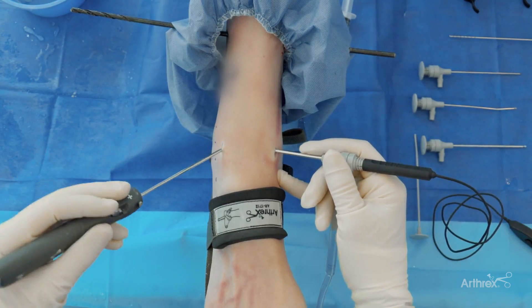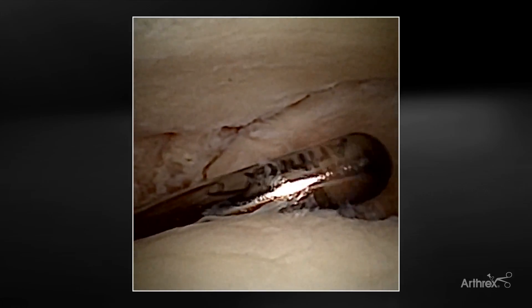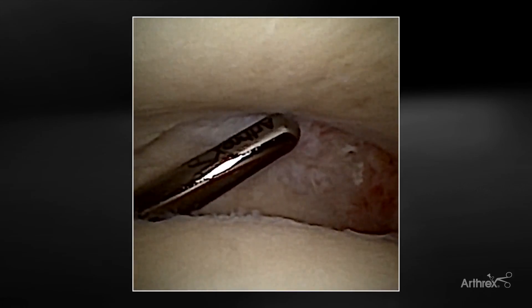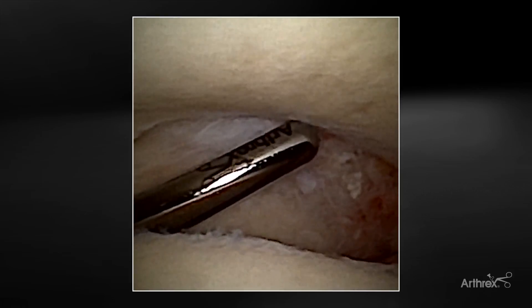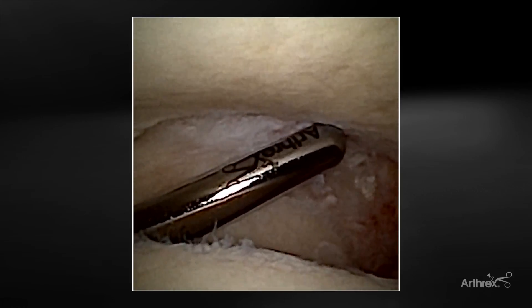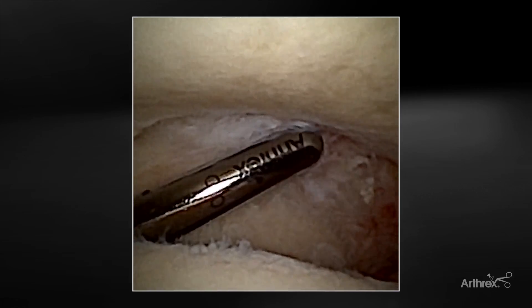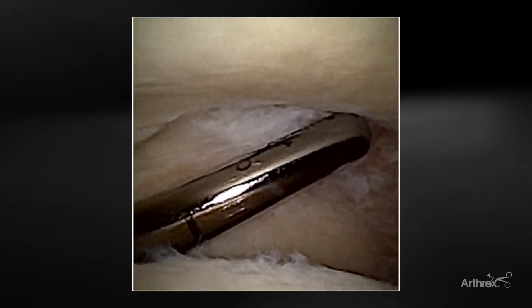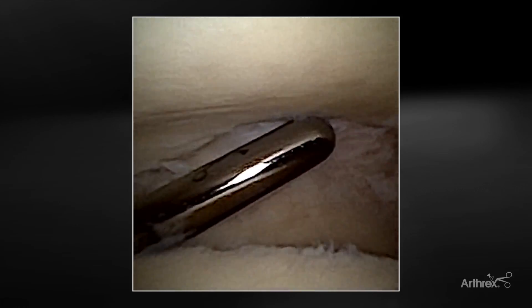You really don't even need these portals. We have our tibia up top, our talar dome, the shaver over here against the syndesmosis and the fibula. I'm a 4-0 scope guy traditionally, but with this I can get to the back. I can do all kinds of things with this, especially in those arthritic ankles. Those that have large spurs — sometimes you worry they don't get as much distraction, so it's a tighter space. These little nano instruments have been really nice.